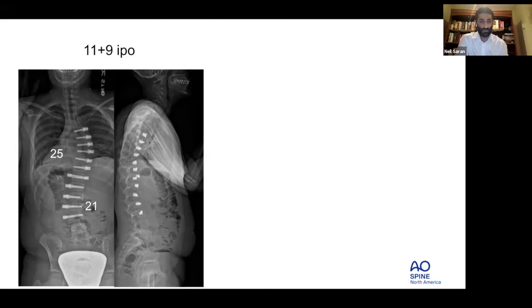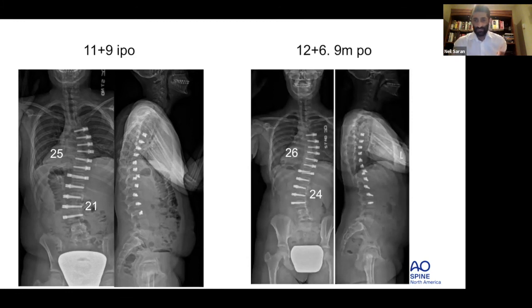And so it's harder. I remember her psoas was huge, and I had to work to get to the 50% mark. And so I kept the tether a little bit posterior at L1 and L2 to try to compensate for that. And we'll see what happens in the long term. So that's kind of her. So here she is 9 months later.